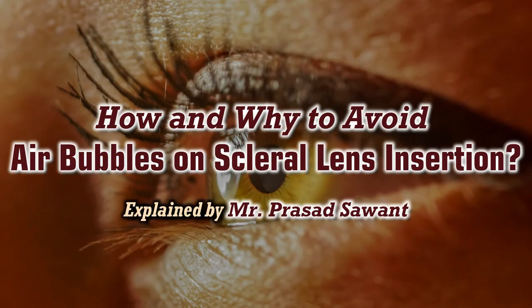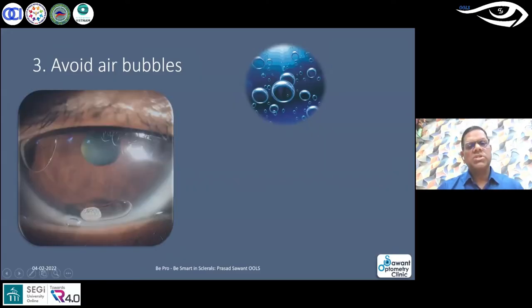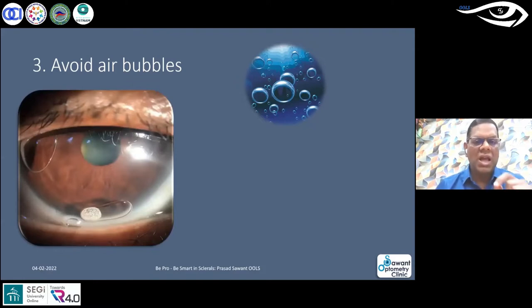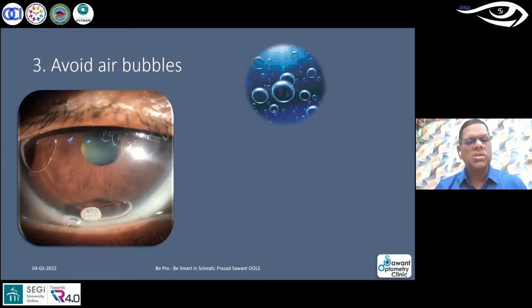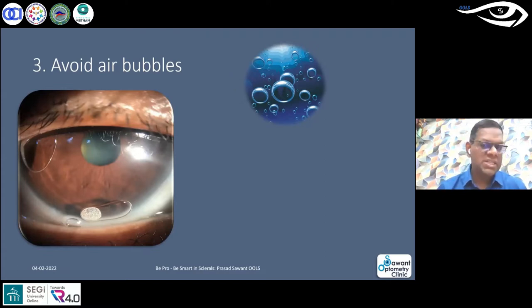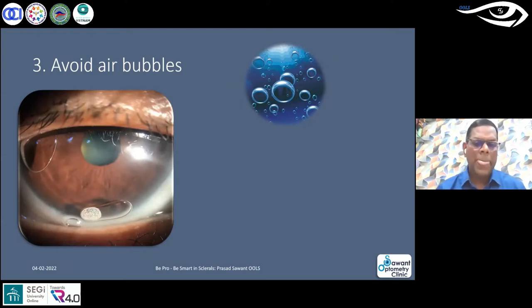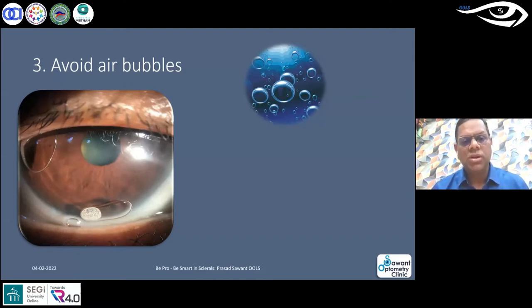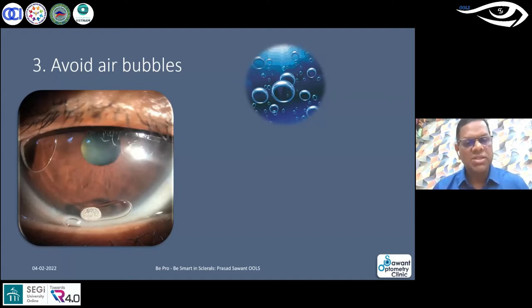The third pearl is very important — you need to really avoid air bubbles during the insertion process of a trial lens. At first instance, as a practitioner, you are going to insert the first scleral lens in the patient's eye. The patient doesn't know what it feels like, so you need to counsel them well. Show the lens in their hand and tell them that even though it looks really big, there's no need to worry, because the edges of the lens are going to rest on the white, insensitive part of the sclera. Your continuous counseling should always be there — tell the patient to just listen to your voice and follow the steps, so that the practitioner will have a comfortable insertion process.